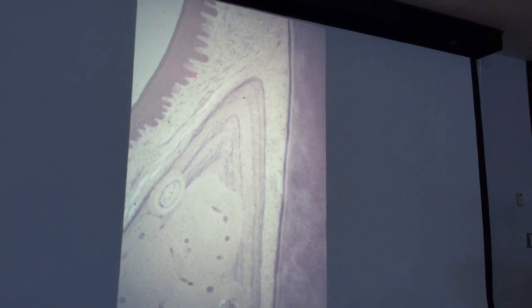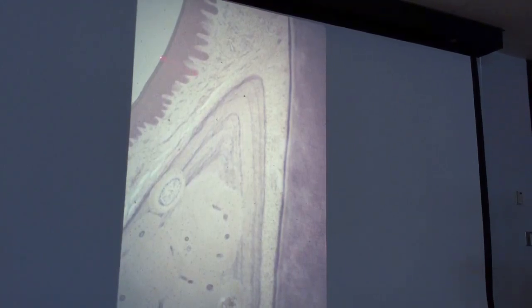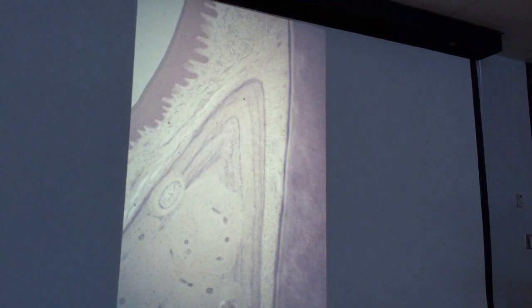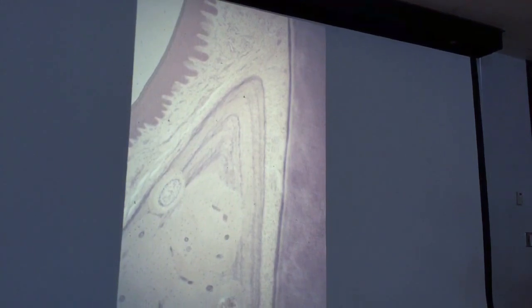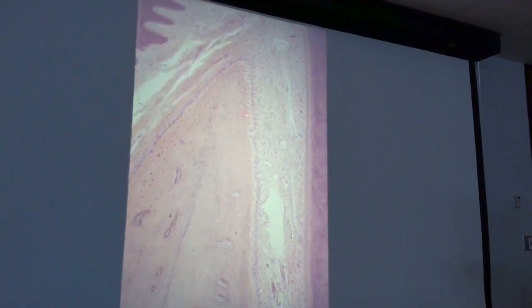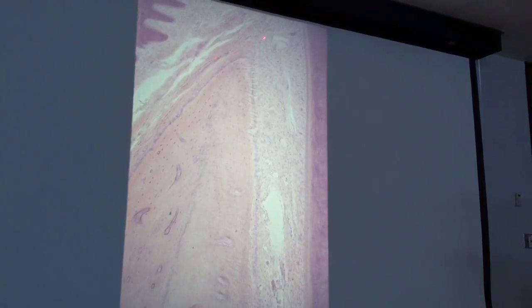And what kind of tissue is this? Kind of hard to tell. It is a keratinized stratified squamous epithelium. Really can't get a good shot at the nuclei, so probably orthokeratinized, but we'll come to another one of those. Okay, how about these fibers we see right there? Sharpey's fibers. And that fiber group we see right there again is what? Dentoperiosteal fibers.